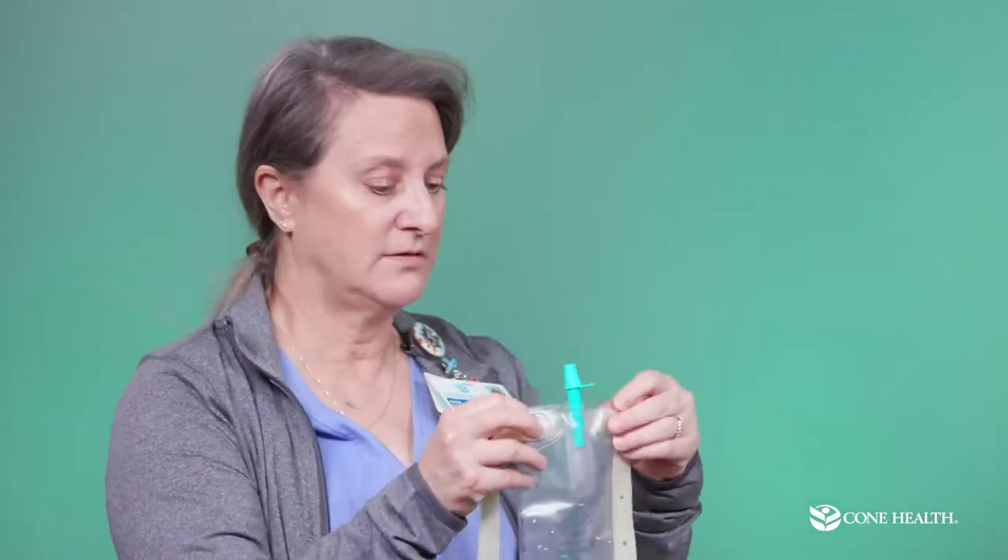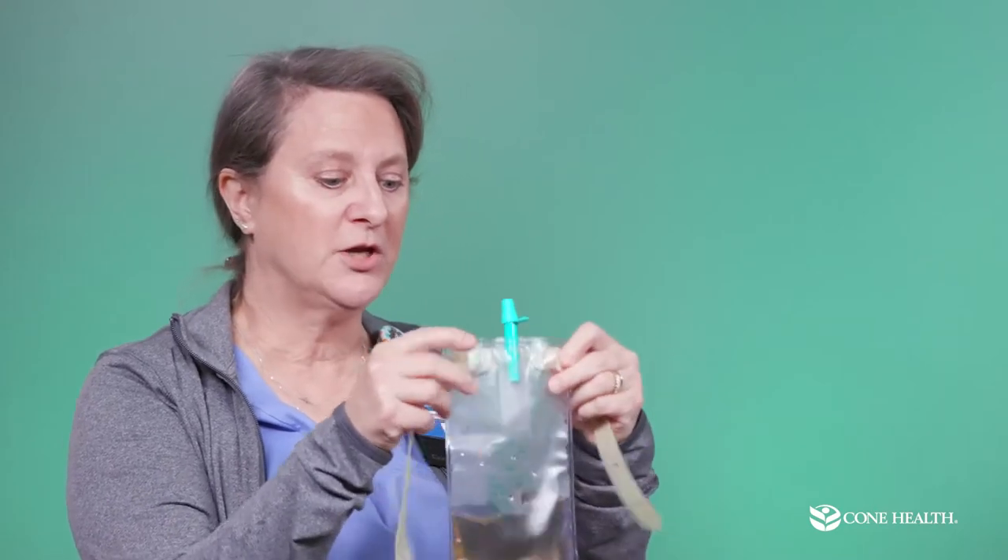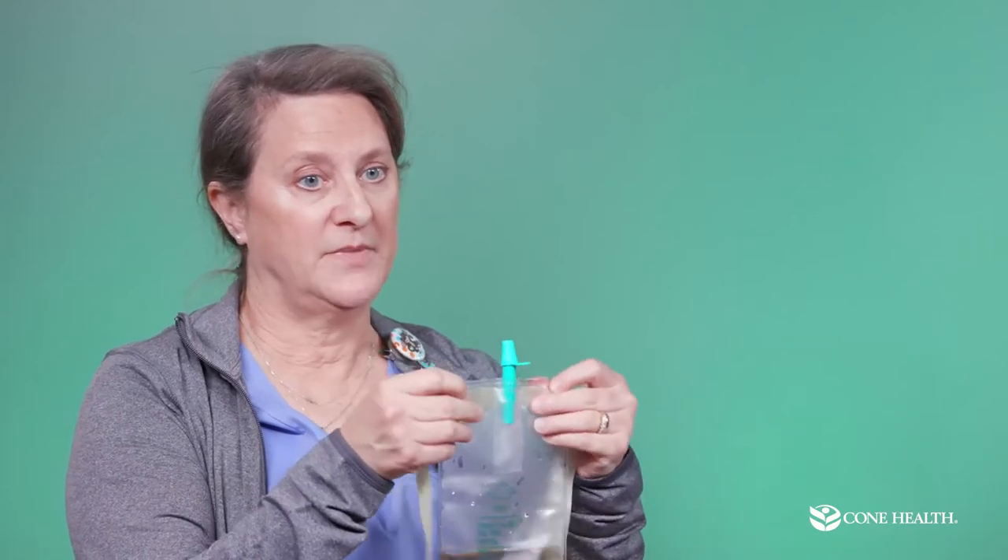This is our smaller bag — we call it the travel bag. A lot of guys put this on underneath their pants to go places while they have the catheter in. You should empty it when it's half to two-thirds full. We'll show you how to switch the bags in a little bit and discuss the importance of the green caps. It's okay to get this bag wet in the shower too — just towel dry it when you get out.